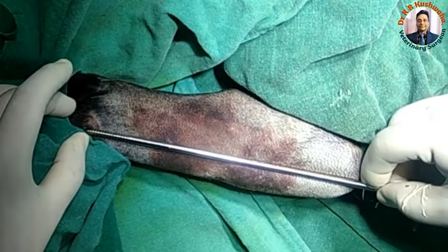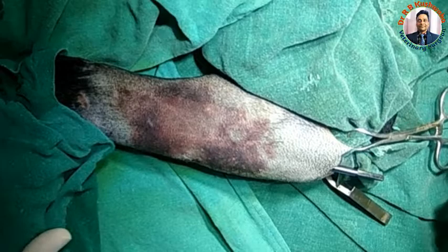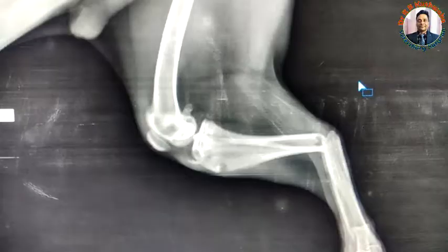Now I will take the radiograph, and if it is okay then I will just cut from here and that completes the procedure. I will come back soon after the radiograph.